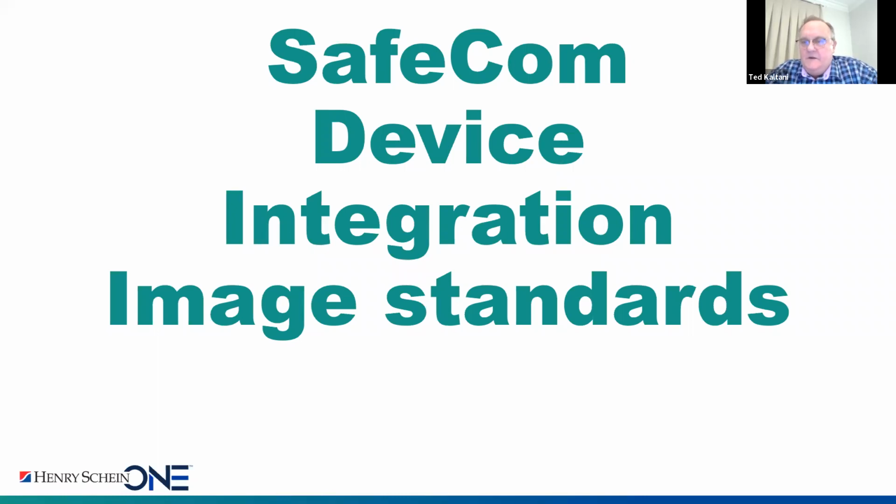What are these imaging standards? These are the standards that allow you to connect one device from any manufacturer to any application. So an easy way to understand that is, if you ever use Photoshop, for example, Photoshop is a generic imaging software, one of the best in the whole imaging industry. Photoshop is standalone software. If you buy a product from Sirona or from another vendor, is there a standard that can connect the device directly to your Photoshop? Probably not. Probably it is. Well, there are standards. There is a Twain standard.